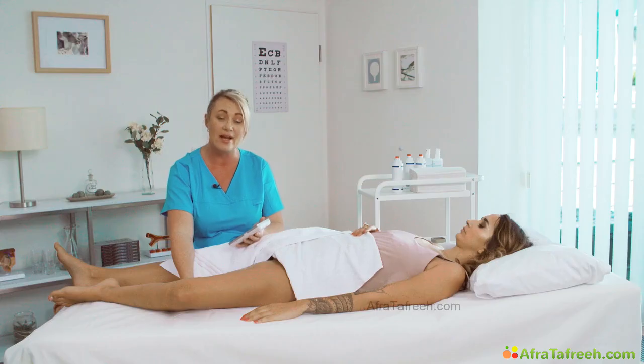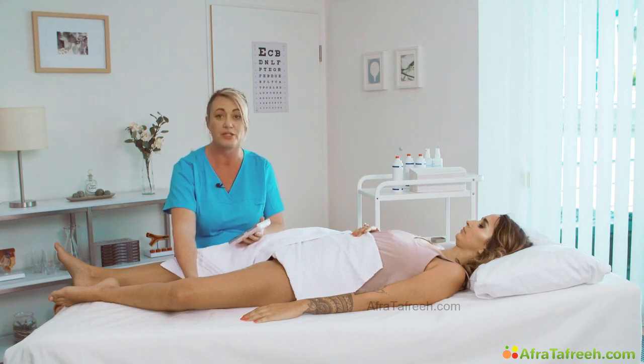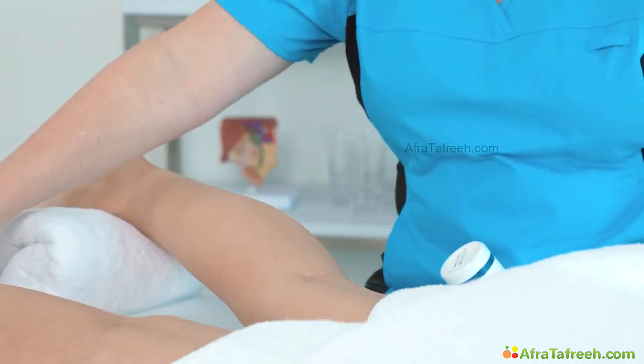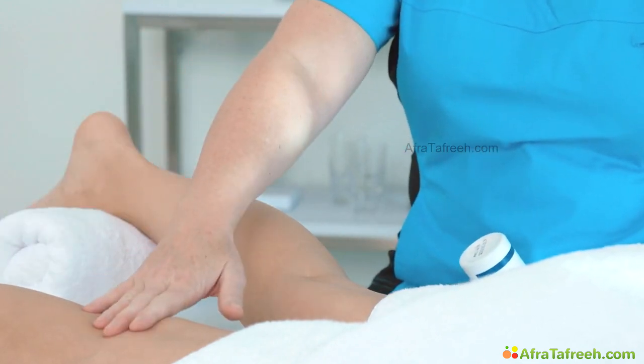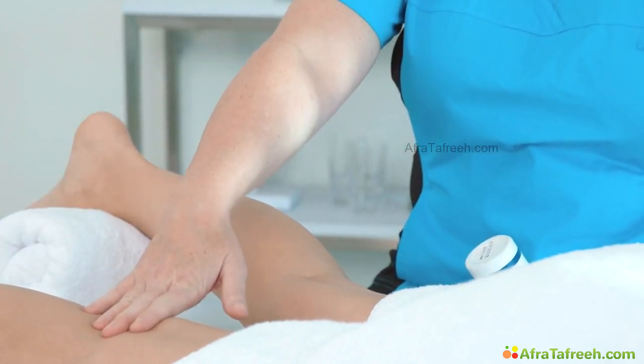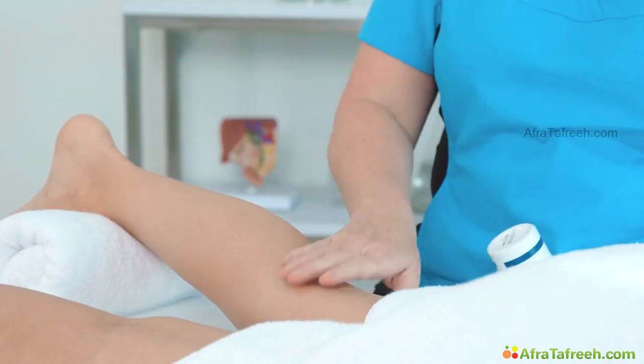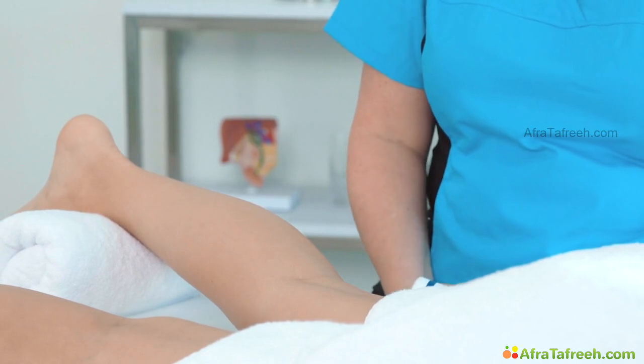And now we're going to ask the patient to roll into a prone position. This will allow easier access to the popliteal fossa if you're finding this position a little bit too difficult. So now we have the patient in a prone position with a towel rolled up under the ankle. If we have the leg extended completely like this, the veins automatically compress in that position. So it's a good idea just to have slight elevation on that leg to allow us to see the veins much easier behind the knee.